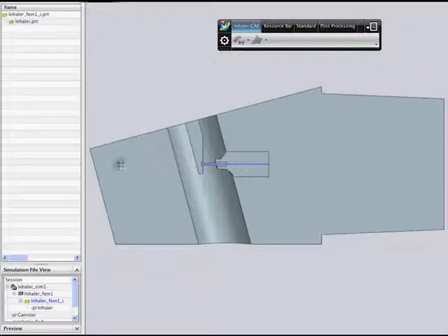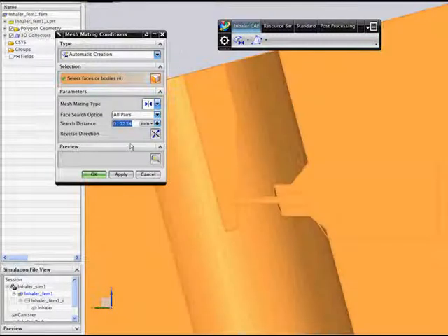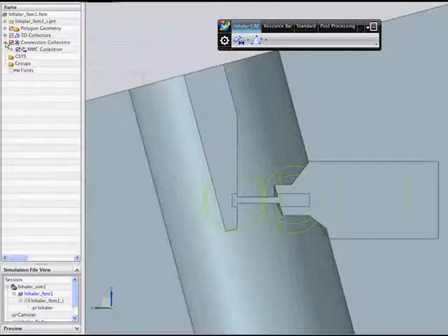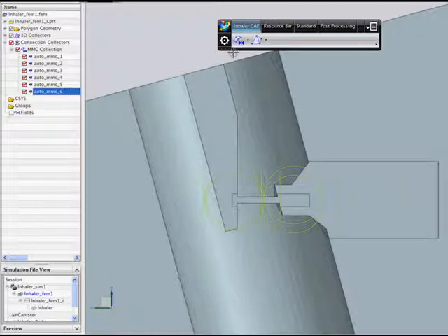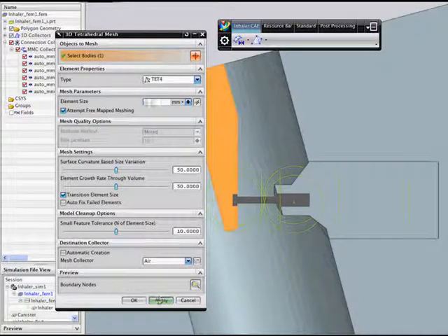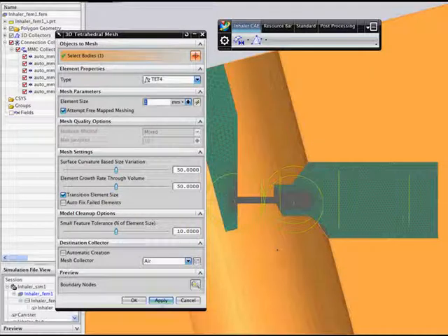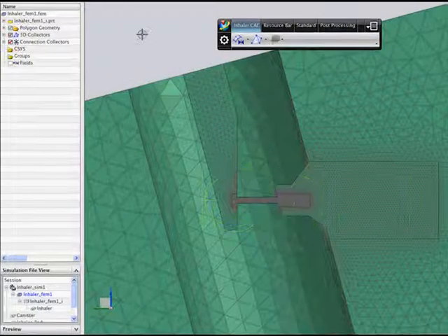First, create mesh mating conditions between the bodies to make sure the meshes will connect. Then mesh the nozzle and air volumes. When creating the mesh, it's important to use an appropriate mesh size to capture the flow field through the regions of high variation in the injector nozzle. Finally, assign each mesh a material, such as air for the fluid volumes.